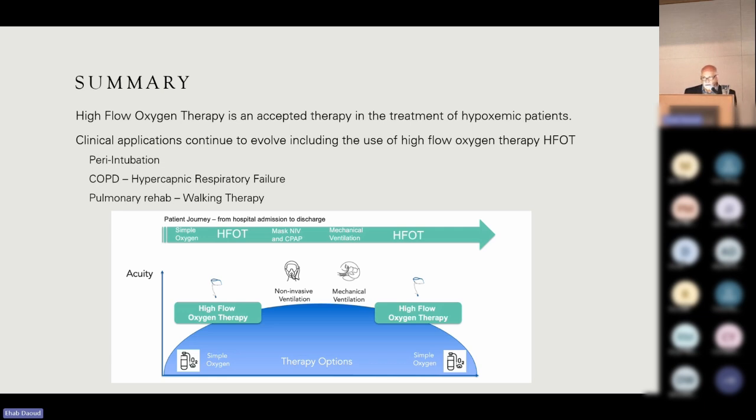In terms of high flow, there was another part of that question, whether larger cannulas in the adult areas should be used, larger diameters. I'll tell you that, again, it goes back to the manufacturer. And if the manufacturer offers you a cannula, then they have done the testing to assure that that cannula does 2 things. One, that it's capable of delivering the appropriate flow, but secondly, that the alarms that you have in place, like disconnect or circuit occlusion, actually work as well. So I think it's important to have larger cannula sizes. Of course, pressure is an issue, but I think we will see smarter cannulas, and I think we'll see large bore cannulas as well. Okay, thank you.